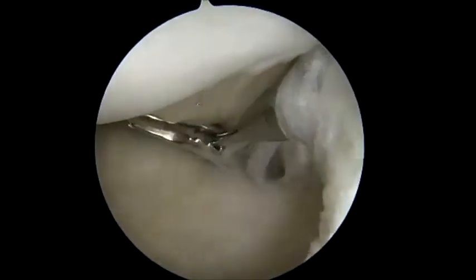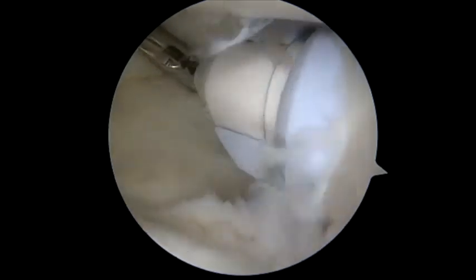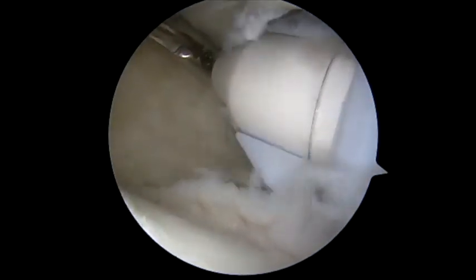You can see here we've made a low posterior inferior portal. We're dilating and placing a Gemini cannula. This portal is usually two to three centimeters inferior on the glenoid to your regular posterior portal. We're viewing from a posterior portal with a standard 30-degree scope.